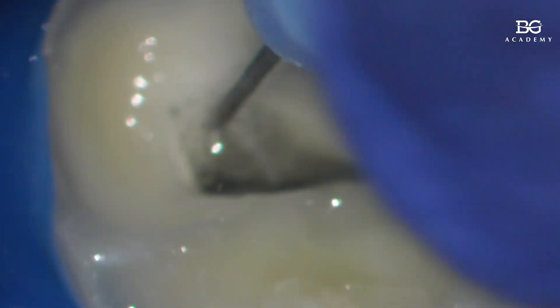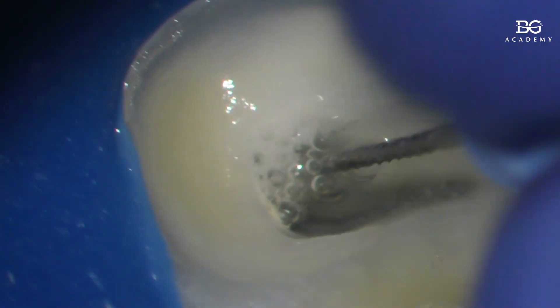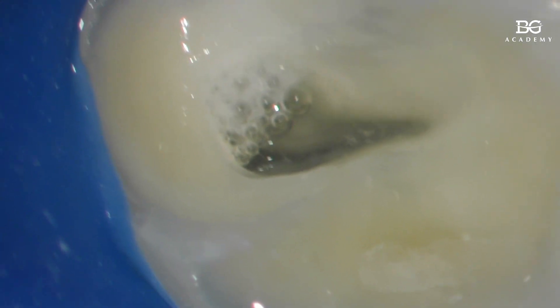Now it goes in completely freely — look at that. So now with the hand file, I'll just scrape it a bit. It went in deeper — I scraped a bit without that feeling of resistance. How much is it now? It's definitely 19 millimeters already. Do you see the level? So basically, we've determined the working length for the ProGlider.